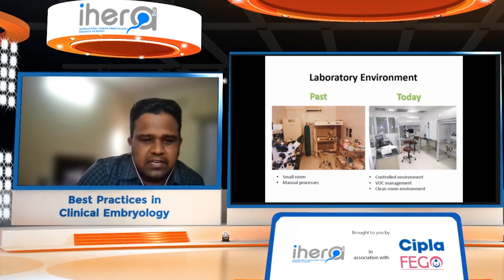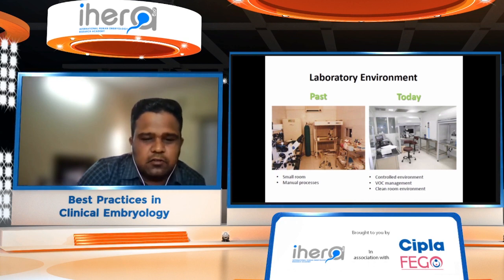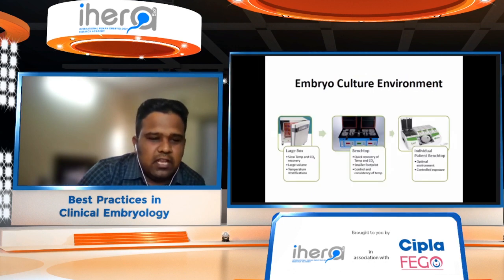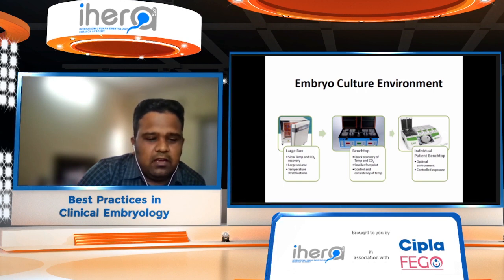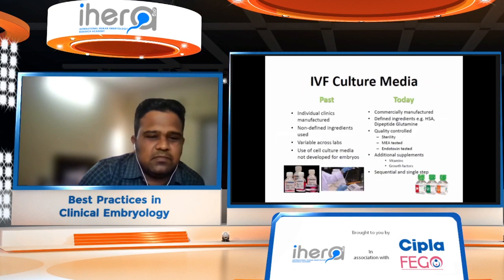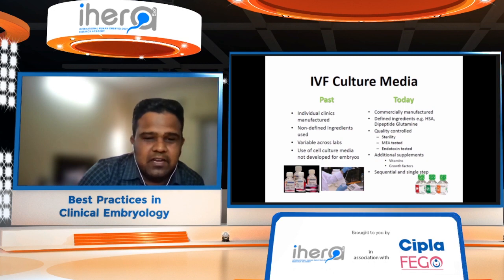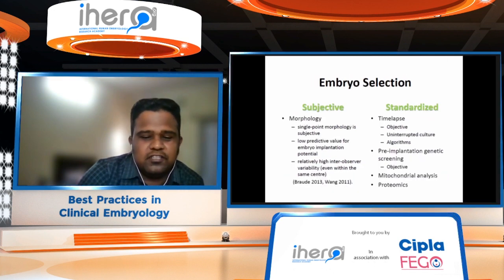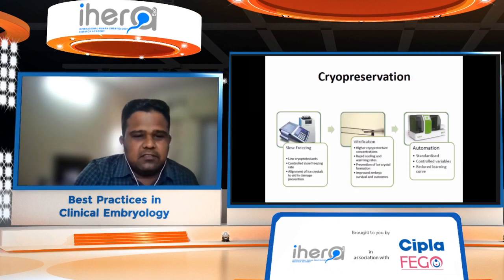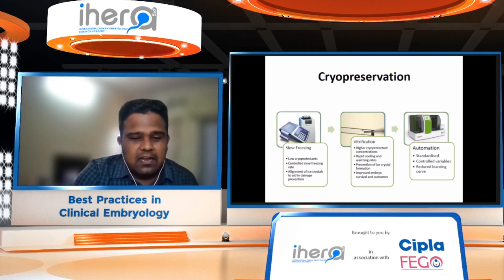IVF, and at present times we have seen advancements in every aspect of ART, whether it is the laboratory equipment and devices or the embryo culture systems. We have seen advances from bell jars to benchtops, now time-lapse systems, from handmade, self-made culture media to commercially available media, embryo selection from morphology to time-lapse, and now into the PGT era, cryopreservation, and now we are talking about AI automation in ART.